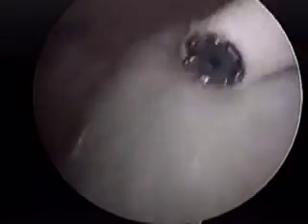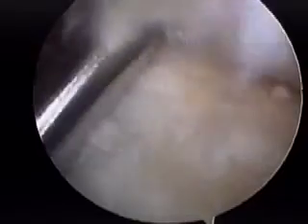That was fine, and then we started to look at the tendon. So now we are looking at the posterior superior cuff. Now we are seeing our Prolene suture marking the lesion. And then we started to ablate the superior fibers and to palpate the posterior superior cuff with the ablator. And at that moment, we decided that there was no reason to complete that lesion, but since that patient was very symptomatic, we decided to perform a rotator cuff reinforcement.